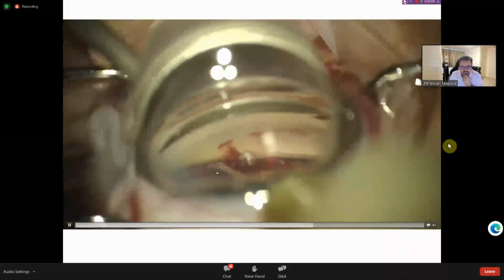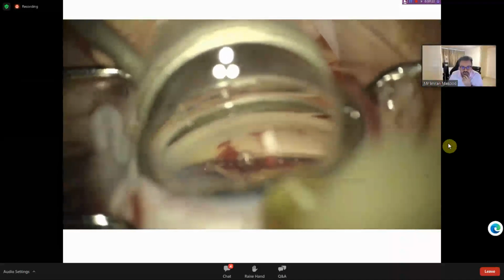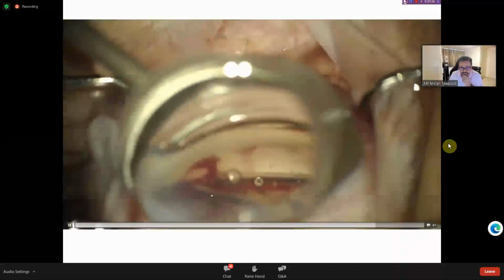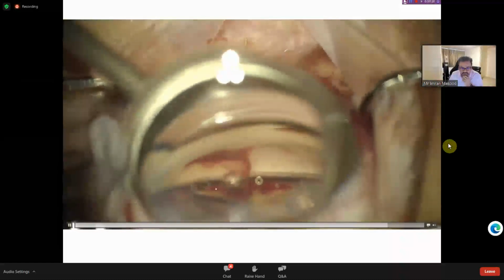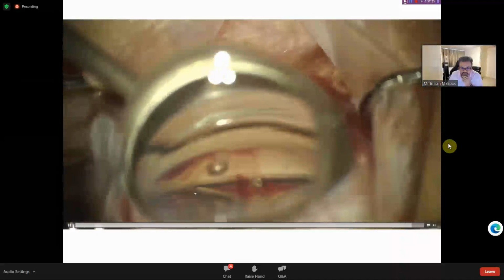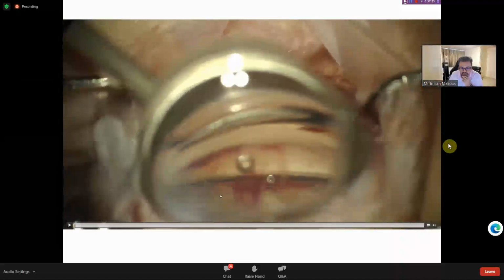So we go in with these, and I think these micrograspers are excellent. These are from a company called MST. Ultimed are the distributors in the UK, and I'm going to plug them because I think these MST 25 gauge micrograspers are very, very good for manipulating these stents. And now you can see that the whole of the flange of the stent is sitting in the anterior chamber where it should be. So you need to be able to manipulate the stents if required.